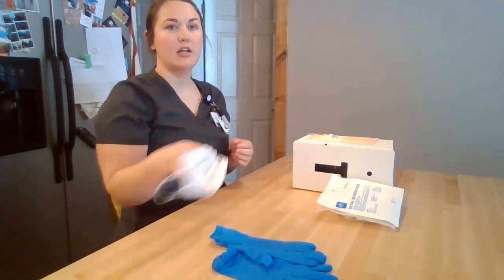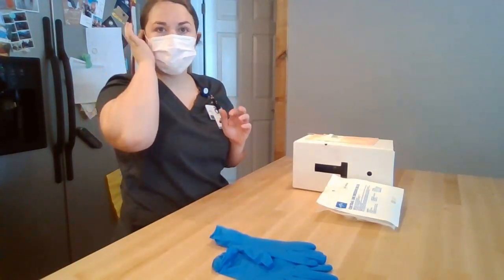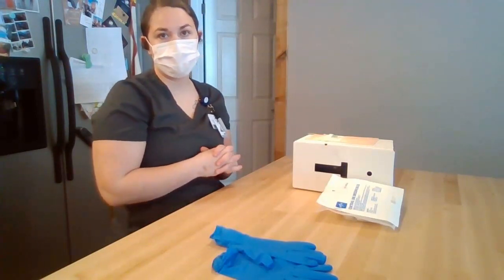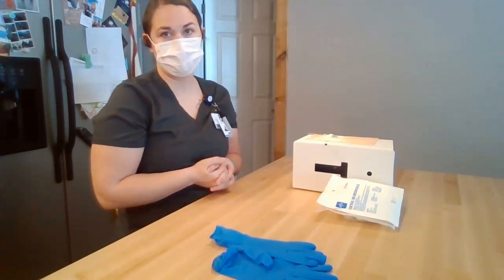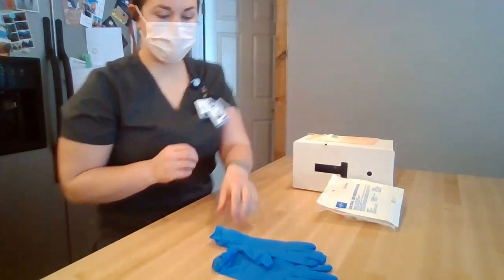I'm going to perform hand hygiene and put on my mask. Once I put on my mask, I'm then going to ask that the patient put on a mask or turn their head away to maintain sterility during the procedure. I'm going to perform hand hygiene and put on new gloves.